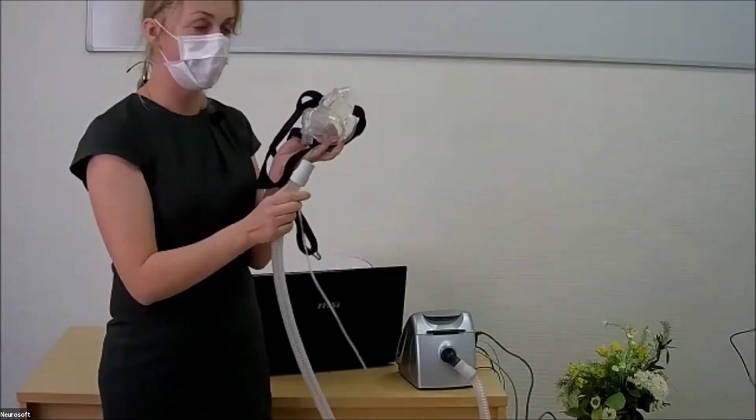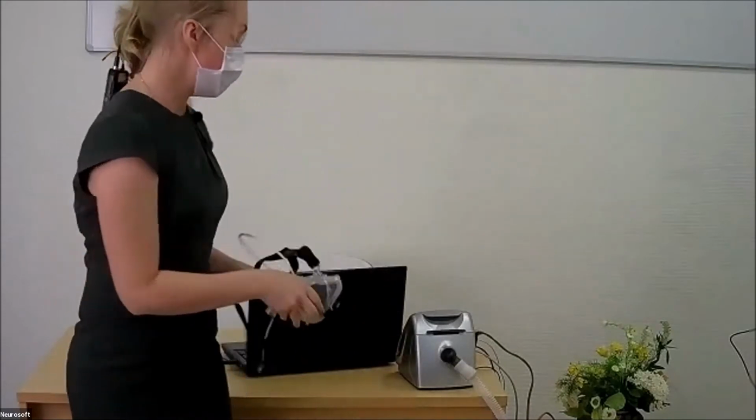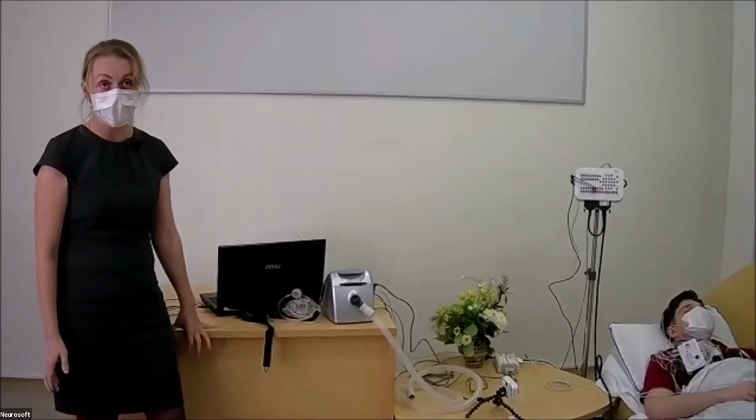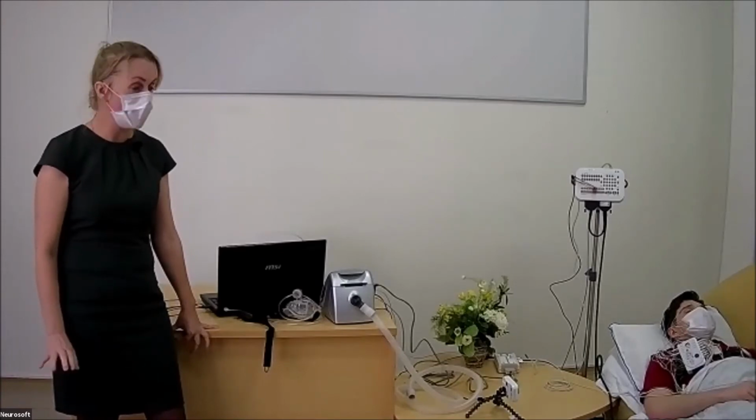And this device is a pump which creates positive pressure in the upper airway for maintaining upper airway patency. The obstruction of the upper airway is the main cause of obstructive sleep apnea syndrome, and this system prevents these obstructions. This is one of the main ways of therapy for this patient.